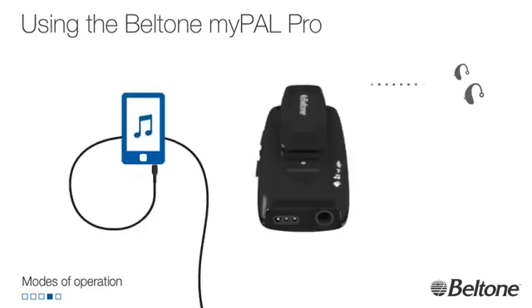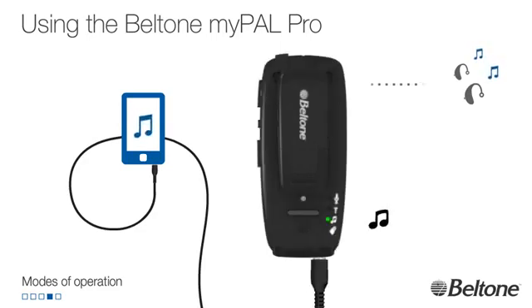A musical note blinks on a smart device screen. A cable connects the smart device to the myPAL Pro. Musical notes flash on the smart device and the hearing aids.